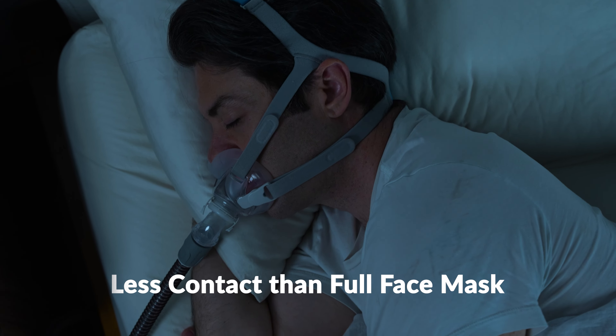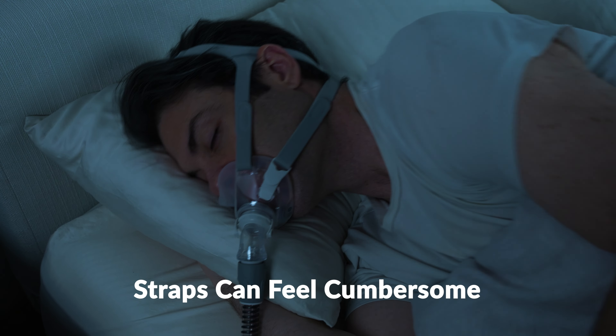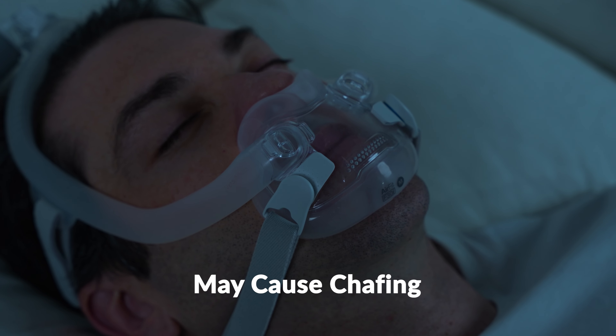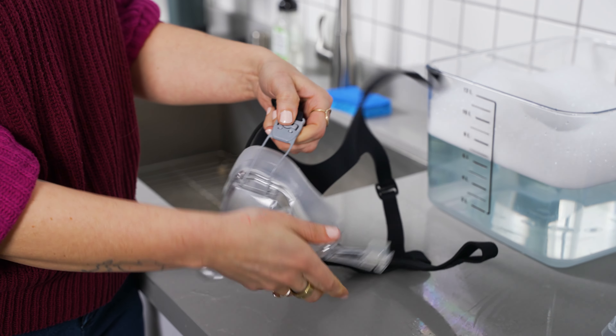Let's examine the advantages and drawbacks of the full face hybrid mask. This mask is great for people who want less contact on the face, particularly those with claustrophobia who have difficulty tolerating a traditional full face style but are still mouth breathers requiring a full face mask. It also provides a snug fit, although it can be a little more challenging to get the proper fit. The drawbacks are similar to a traditional full face style — the straps can feel cumbersome, and it may cause sensitivities under the nose or other parts of the face.